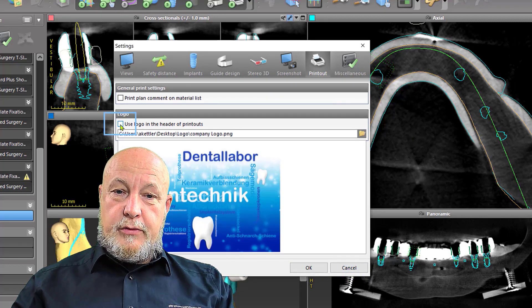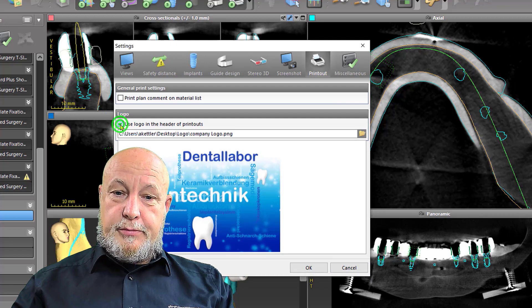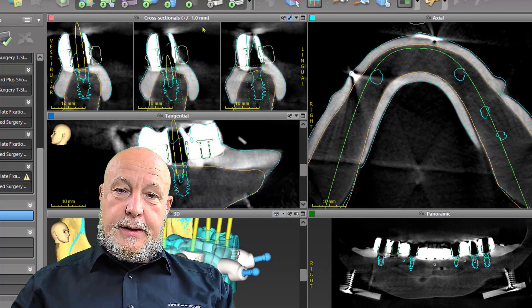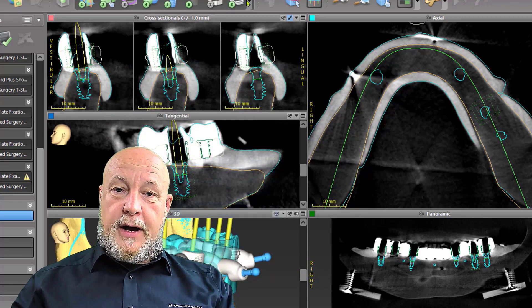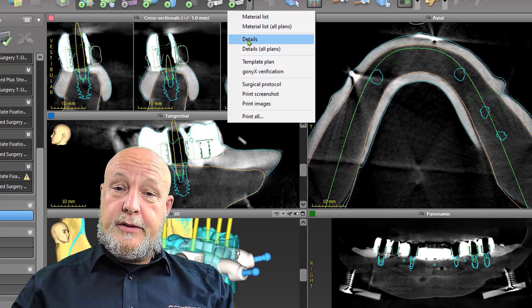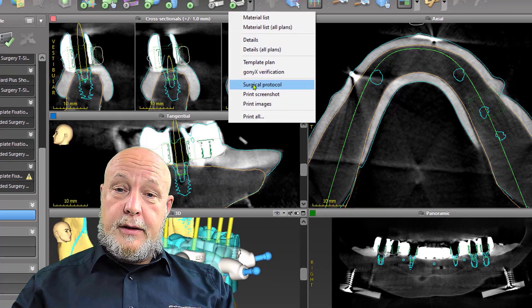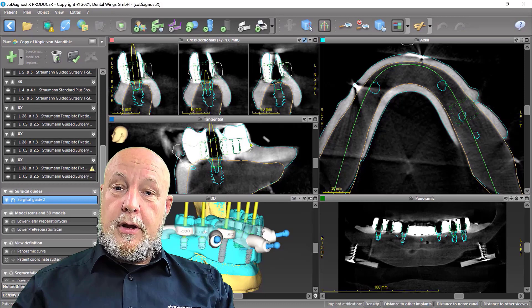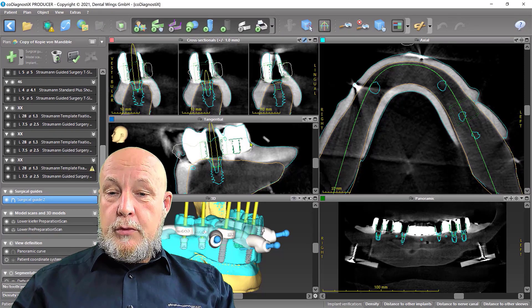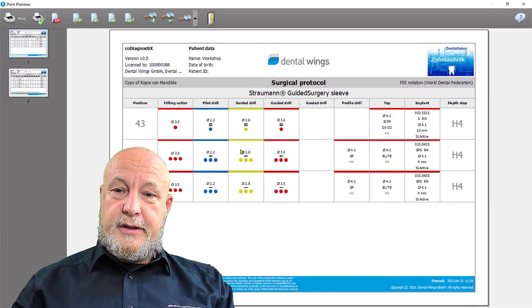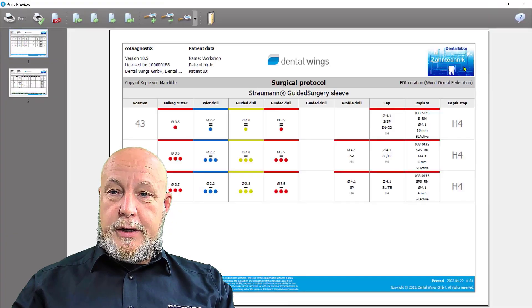to activate 'Use logo in the header of the printouts.' We go on OK, and now you will find your company logo on the material details or on the surgical protocol — whatever you want. Everyone knows that this is produced by you.